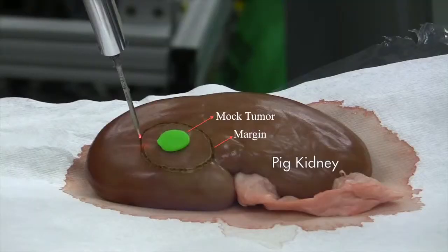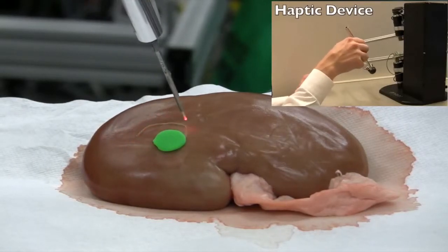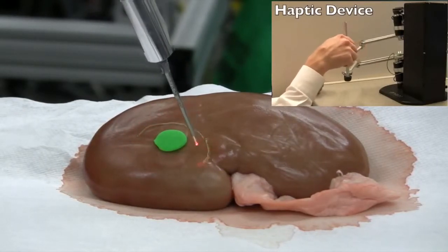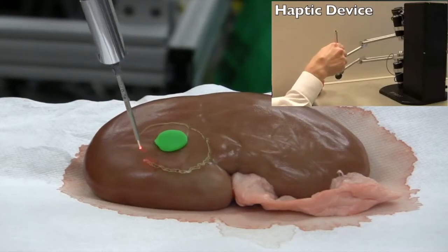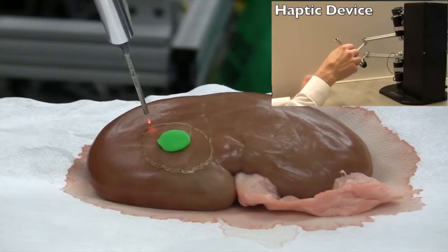As we apply surgical robotics more frequently to these procedures, it's important for us to figure out ways of assisting the surgeons in doing these procedures precisely. The most important thing about any oncologic procedure is to remove all the cancer. If the surgeon violates the cancer margin, it puts the patient at risk for a recurrence of the tumor or continued spread of the existing tumor.